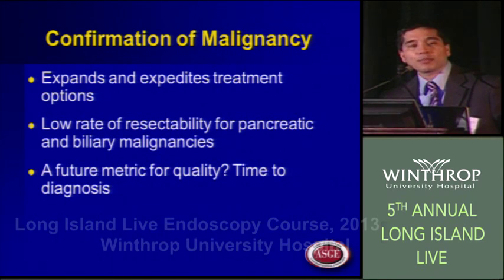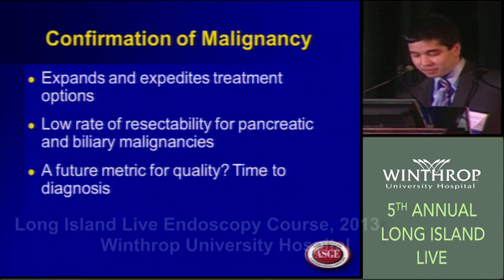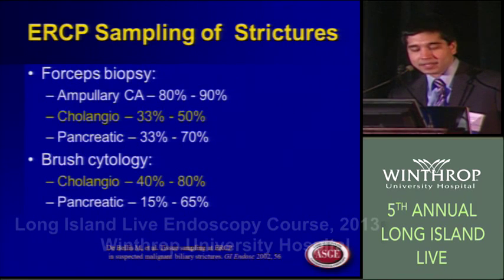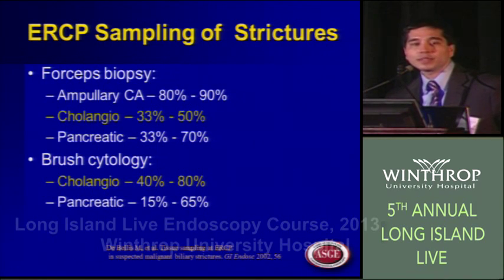They want to have as few procedures as possible. They want an answer, and then they want to know what's happening and then move forward. And that's their perspective. We have to think along those lines. And a lot of this minimally invasive endoscopic treatments you're seeing today are just that, trying to get to the end point of resection and removal or treatment in the case of palliation.